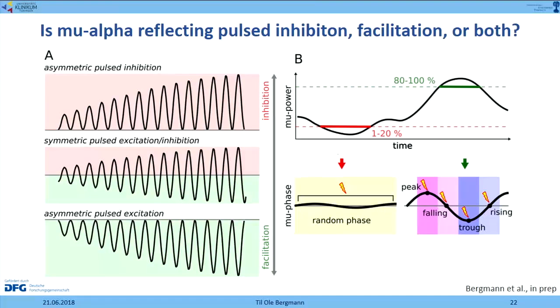And in that case, we could also only target random phase, but for the high amplitude, we targeted 4 different phase angles to see whether there would be phasic modulation of excitability. And we used single pulse TMS to just measure the MEP, so we stimulate the motor cortex, and look at the MEP amplitude as a measure of corticospinal excitability, and we also used paired pulses to assess GABA-A-ergic inhibition by the short intracortical inhibition protocol.